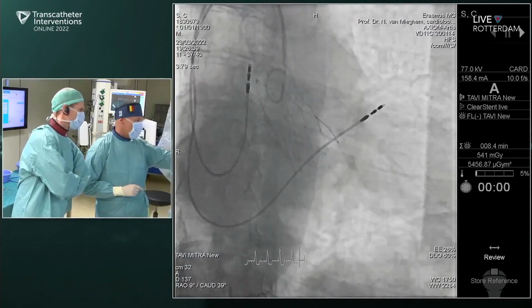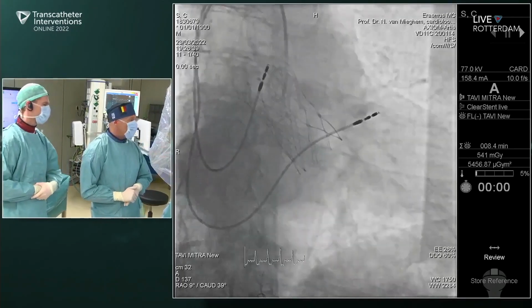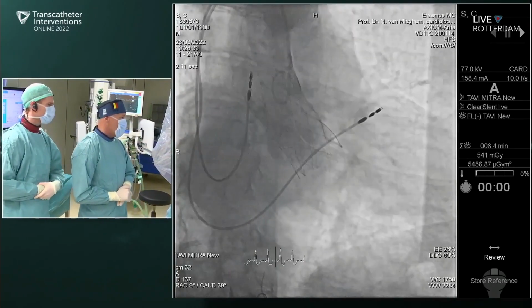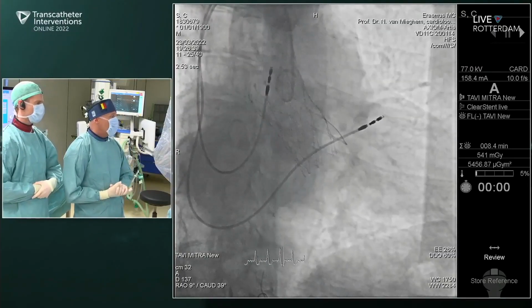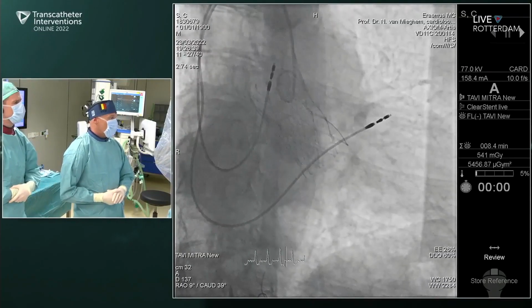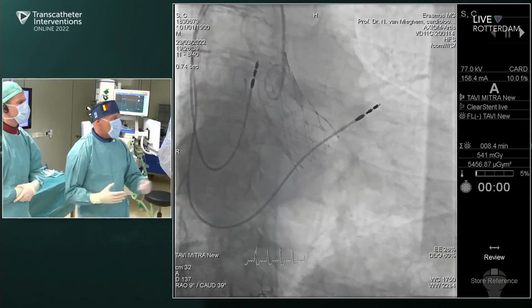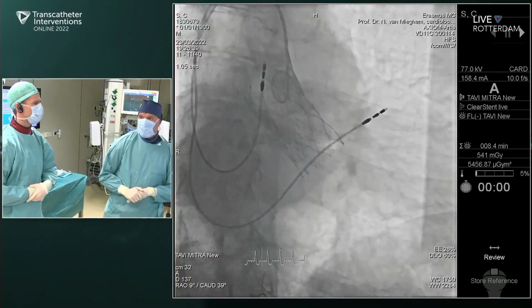What you want to see is that there is one post isolated on the right-hand side, close to the inner curve, and that is exactly what we are having here in this 86-year-old patient with only luminal irregularities in his coronary. So for this patient, I don't think he will face any coronary issues down the stretch. But it's good to know the technique of commissural alignment.